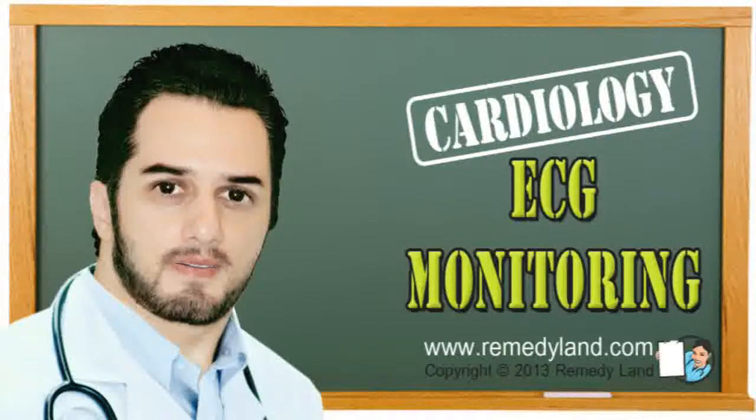Today I want to talk to you about ECG monitoring. With a graphical image on the ECG we can see the electrical activity of the myocardium. The principle of ECG is based on the physical law that a movable wire that passes between electromagnet poles turns when an electrical current passes through it.